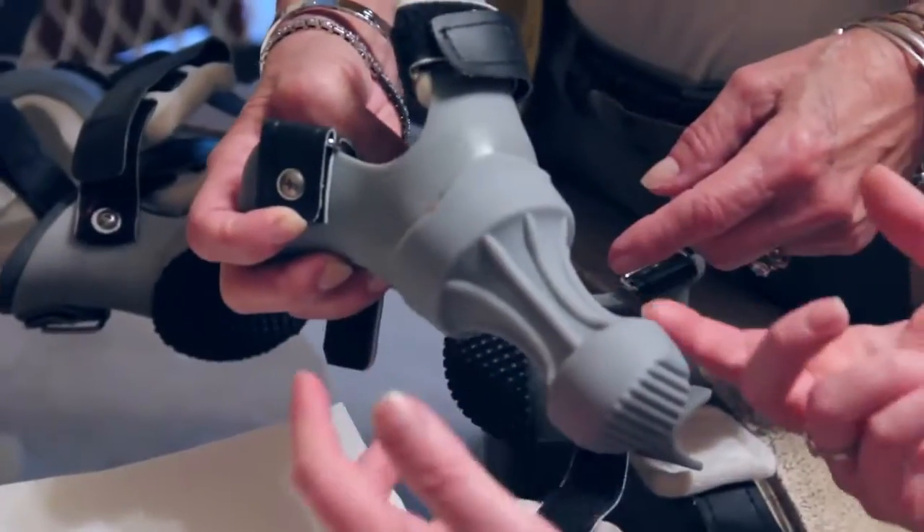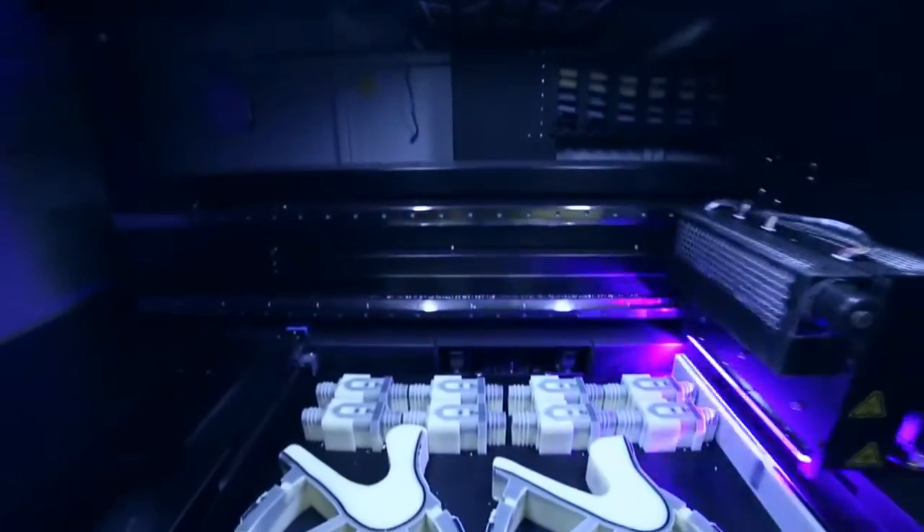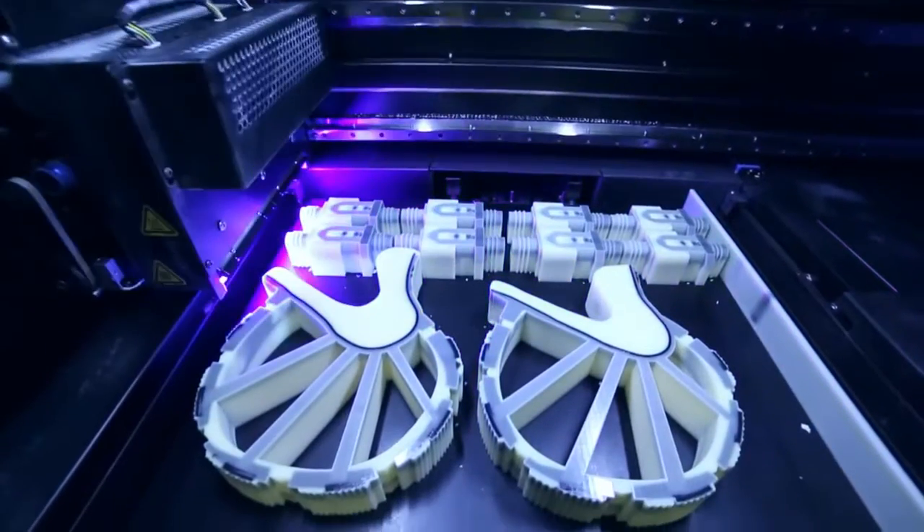With prosthetics in general, a lot of the designs are going to this running man sort of look, and I was concerned that he would end up digging them into the dirt, and so that's really where I came up with the loop idea.